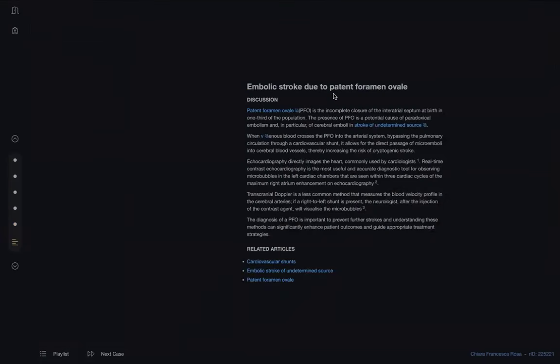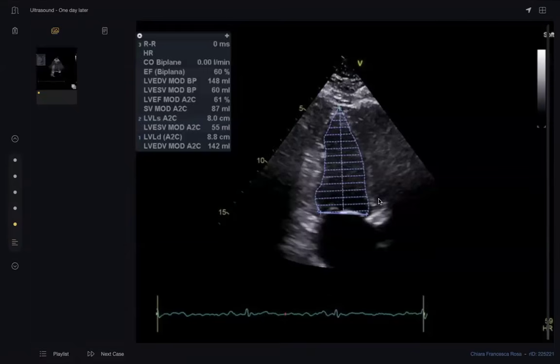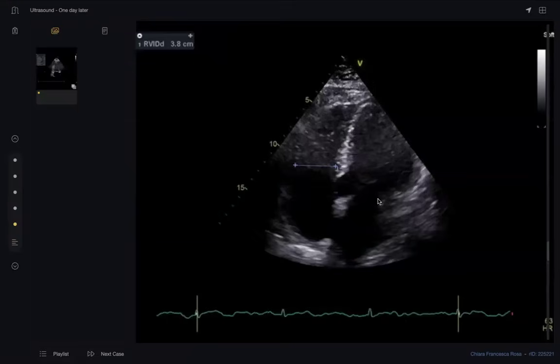Cerebral infarction, and the carotid is normal, and the examiner is showing you the echo. So it must be something in the heart, like patent foramen ovale. I'm not good in echo. I think this or this one. Anyway, the septum must be echogenic and must be completely patent. I think there is an opening here, this one.